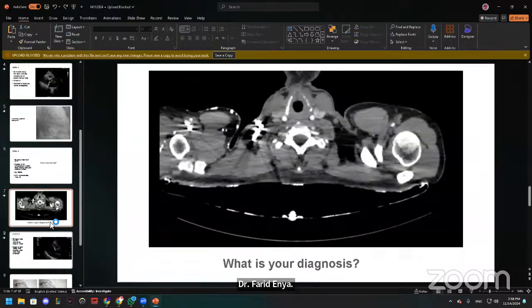Feedback discussion. Yes, and just like you said, as you progress in your residency, you try to look at these images at different planes. Even sometimes a radiologist can help you with special access to look at a specific area of the aorta, for example, at a certain direction.